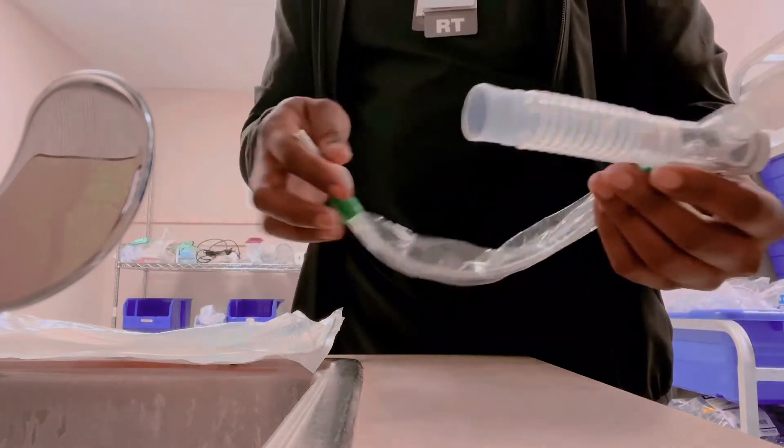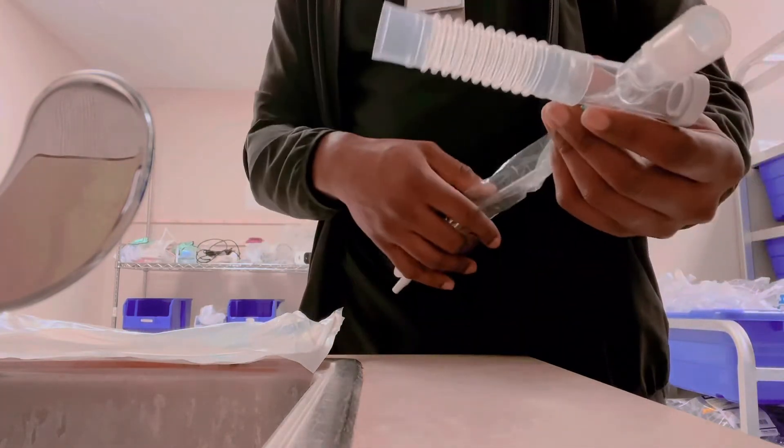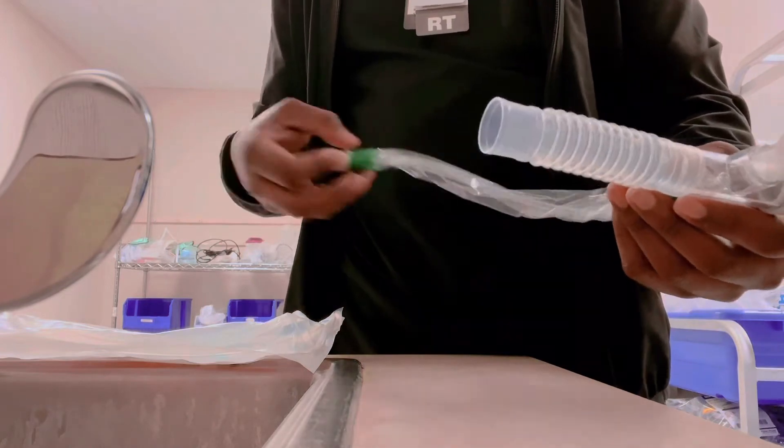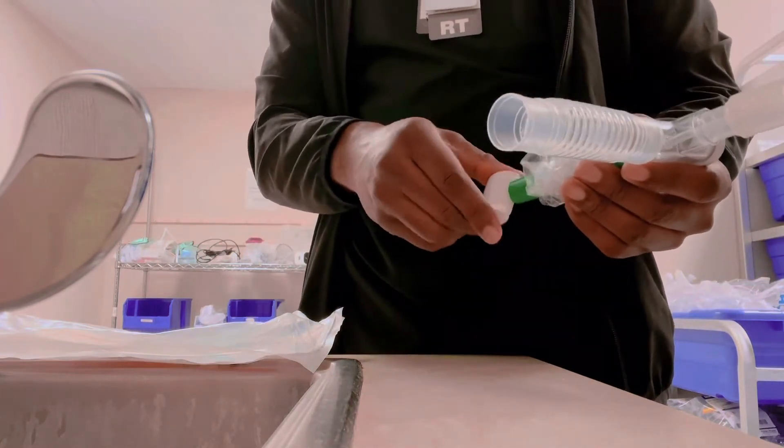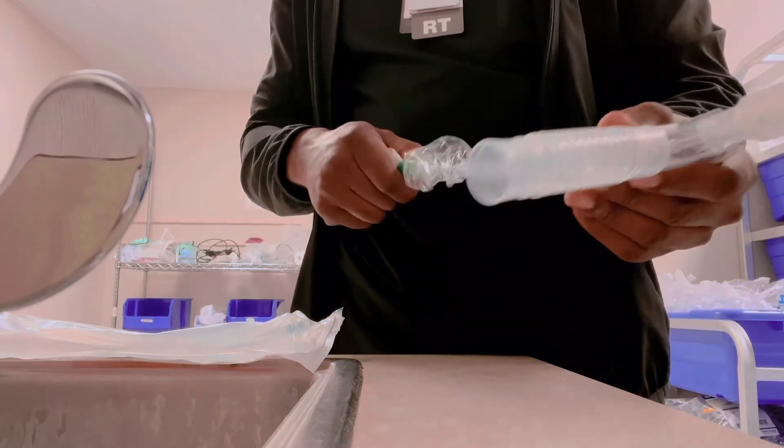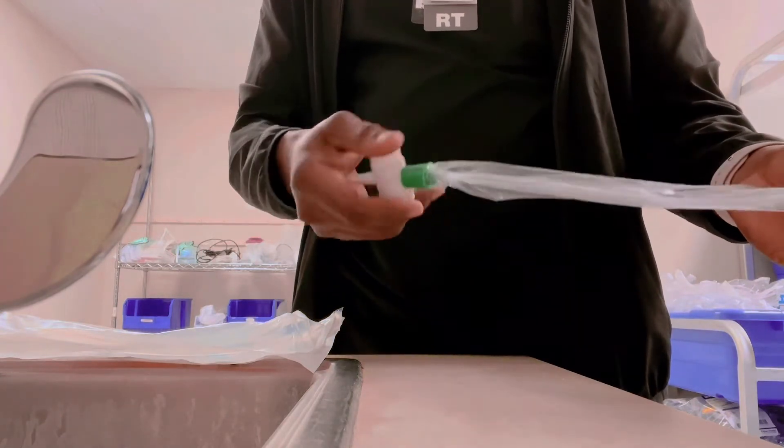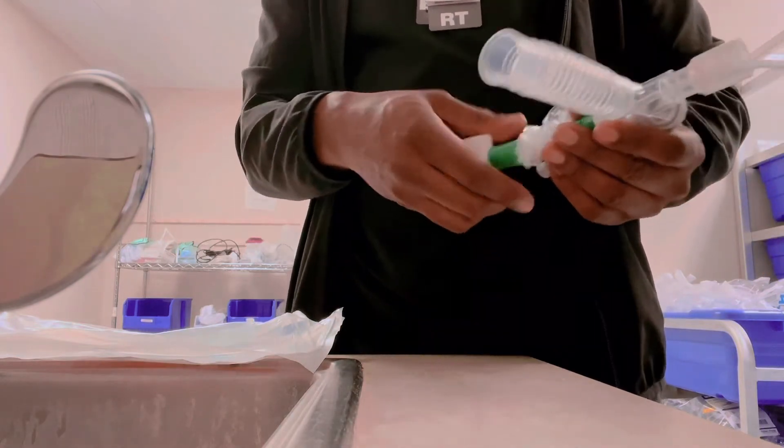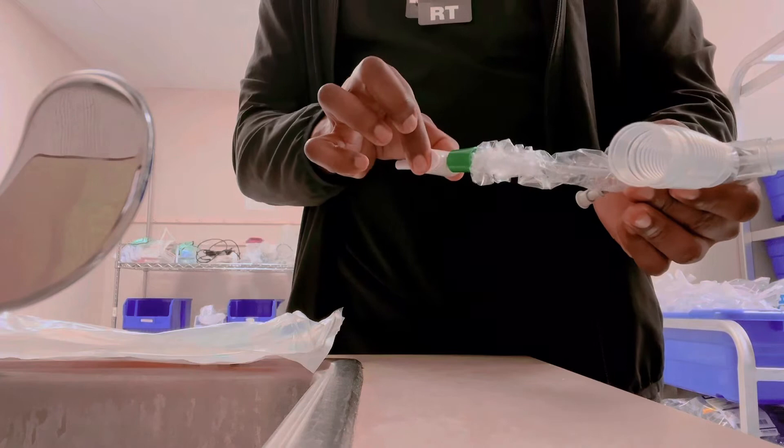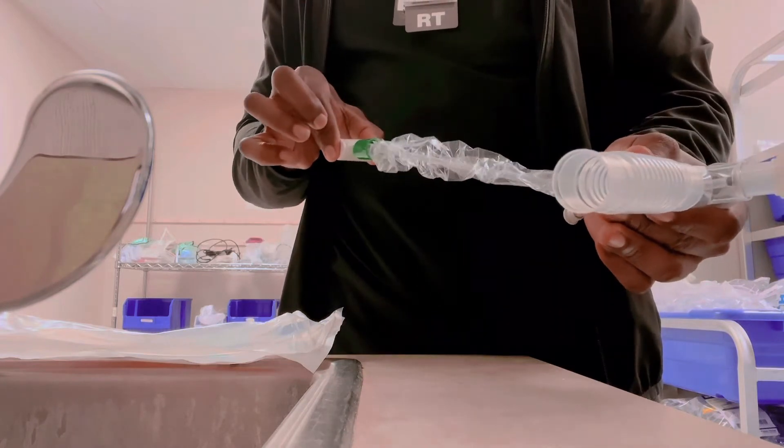I get more effective suction this way. Some people pass the catheter down, suction, and then pull it out, but I think it's more effective to keep the suction pressed while removing the catheter from the patient's airway, suctioning on the way up.